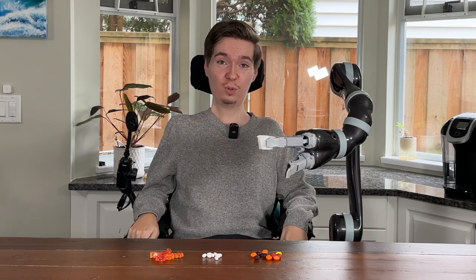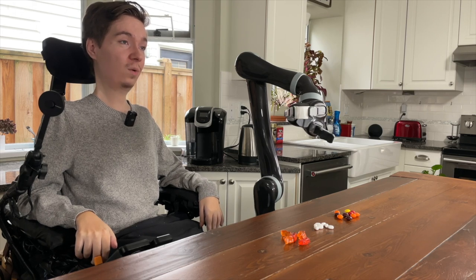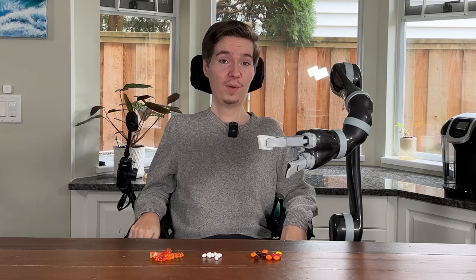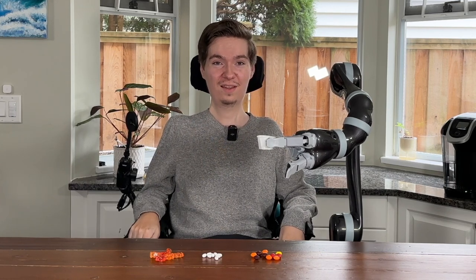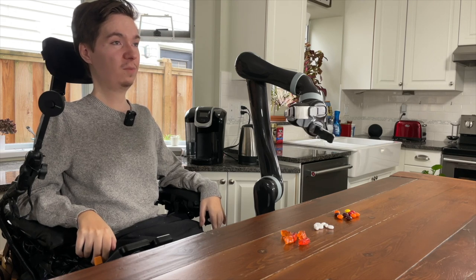We've just explored the two main methods you can use to take medication with Jayco. Of course, there are probably literally millions of different medications on the market, so you can adapt these methods to your own needs. A great way to practice this skill again is by using candy, like I have here. So head down to the store and use this as an excuse to buy a little bit too much of your favorite candy, and practice, practice, practice. This is an excellent skill to develop which grants you a high degree of independence. I hope you've learned a lot and you're able to administer your own medication with great success, thanks to Jayco.